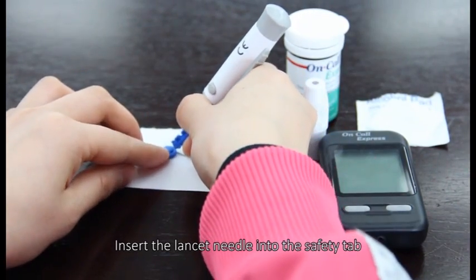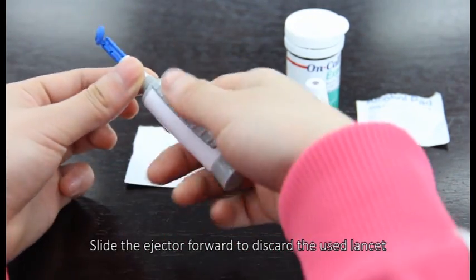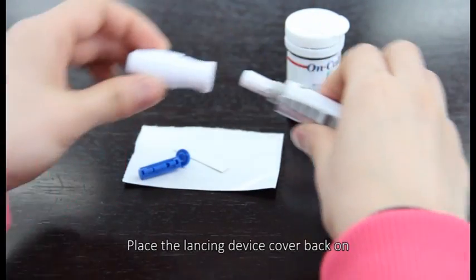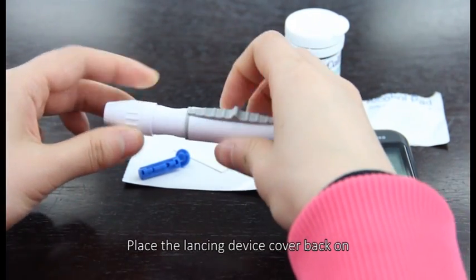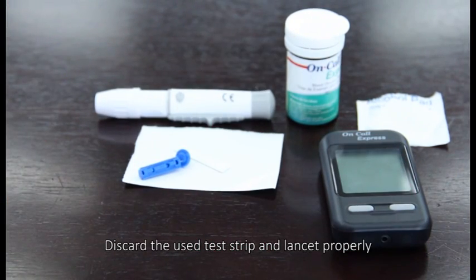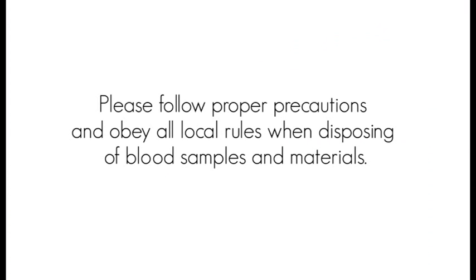Insert the lancet needle into the safety tab. Slide the ejector forward to discard the used lancet. Place the lancing device cover back on. Discard the used test strip and lancet properly. Please follow proper precautions and obey all local rules when disposing of blood samples and materials.